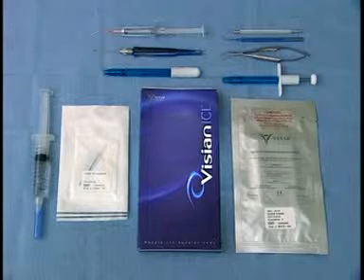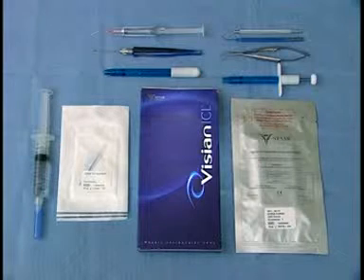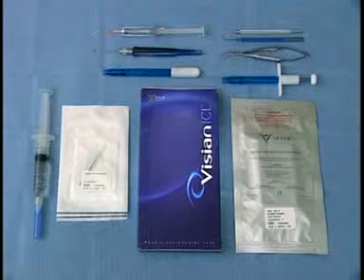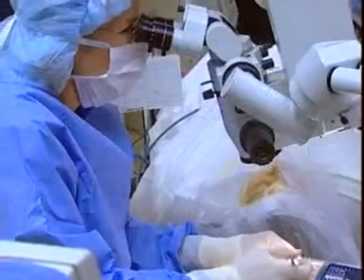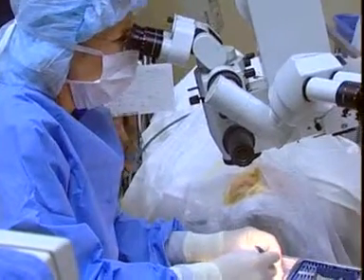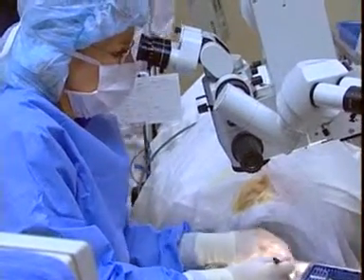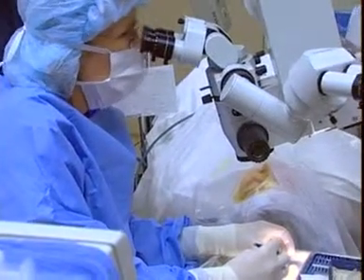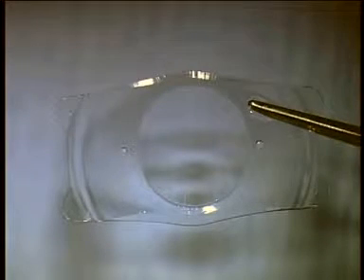Using the Star ICL injection system, the ICL is injected through the MSI-PF, push action, or MSI-TF, twist action injectors. The SFC-45 cartridge requires a 3 to 3.2 mm incision. The loading of the ICL is a critical component of the overall procedure and should be performed under the operating microscope. The delivery of the implant into the anterior chamber is largely dependent on the precise and careful loading of the ICL. The Star ICL is made from Collamer, a hydrophilic collagen copolymer.